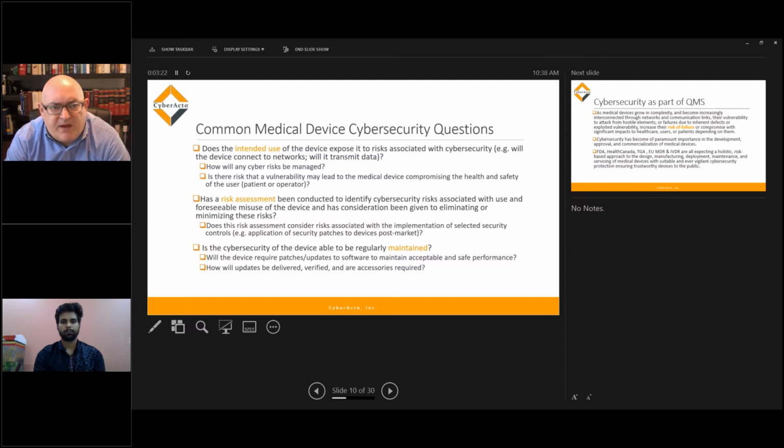One of the things, and I've added this slide, is we got some preliminary questions about this training or this webinar: what are the hot topics when it comes to cybersecurity, especially as clients receive additional information requests from the FDA as part of their submission, or with EU MDR and the notified bodies. So what we see is really three key questions that need to be considered as we go forward, which is: what is the intended use of the device, and whether that use itself will make it vulnerable to risks associated with the device itself.